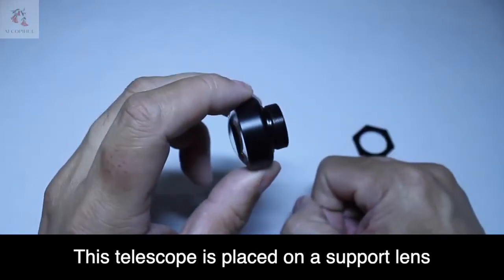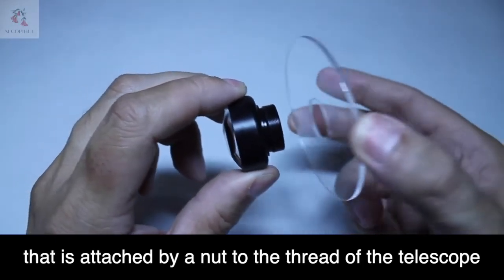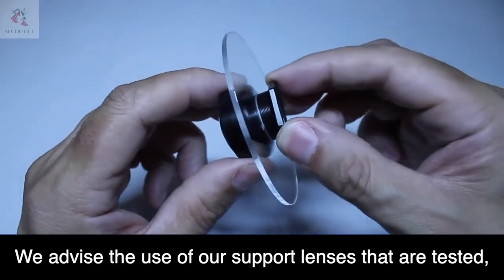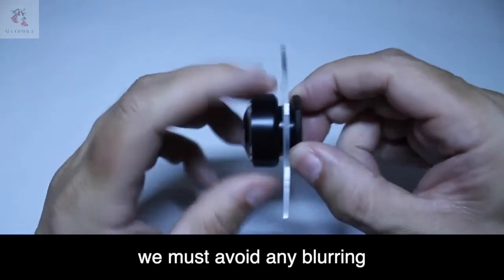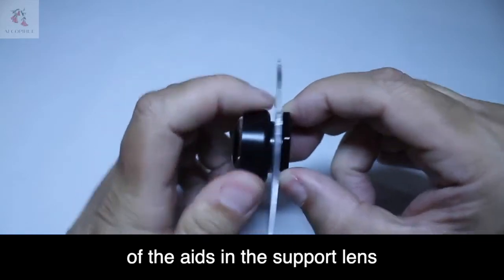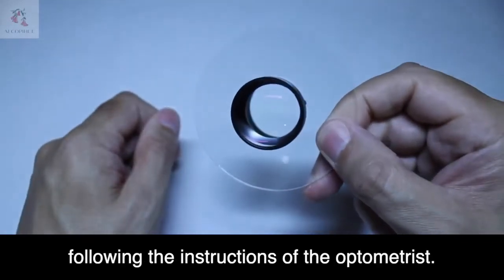This telescope is placed on a support lens, attached by a nut to the thread of the telescope so that it can be installed into glasses. We advise the use of our support lenses that are tested. We must avoid any blurring in addition to checking the correct placement of the aids in the support lens that go into the glasses following the instructions of the optometrist.